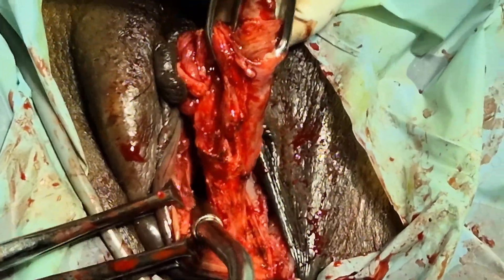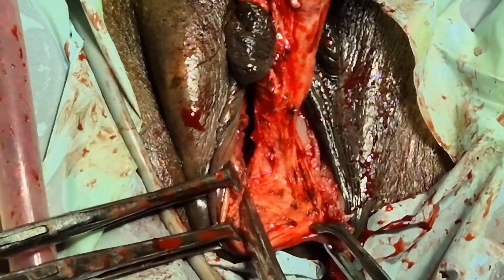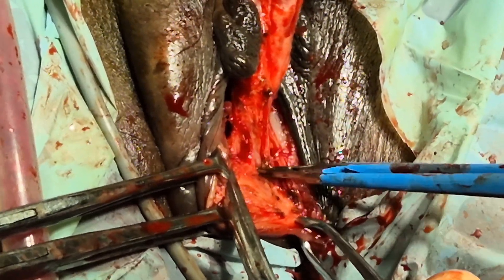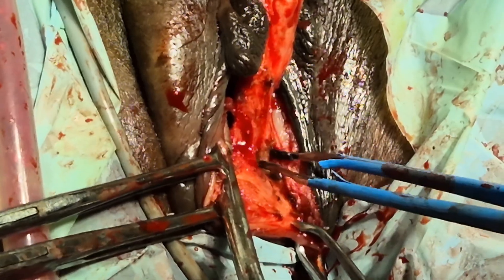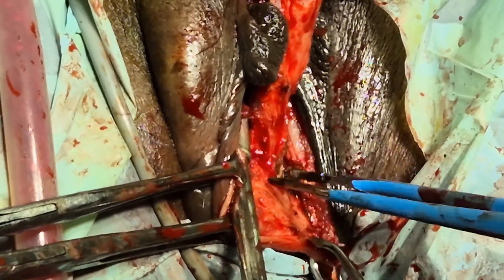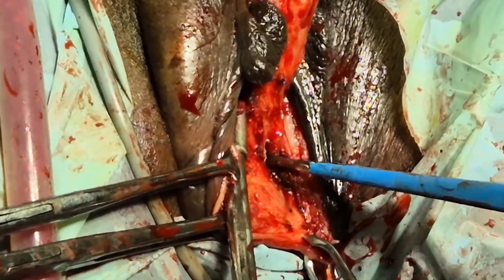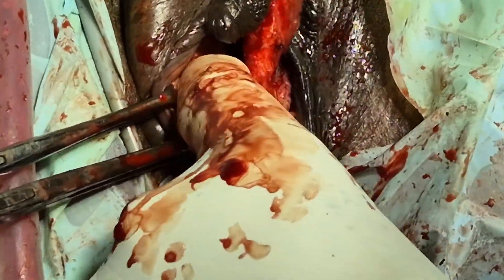It's beautiful here. So, you see how you can access. This section is here like a section in the bipolar heat. This is the bottom. This is the predicate.